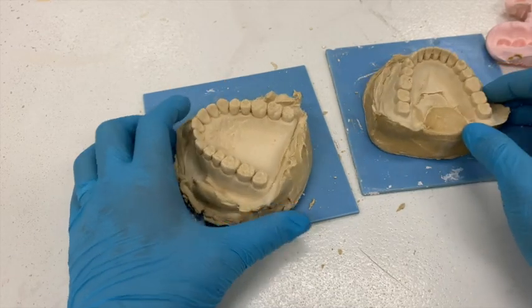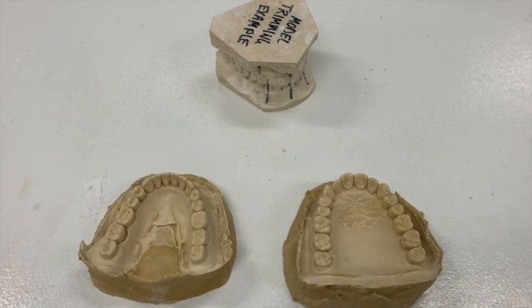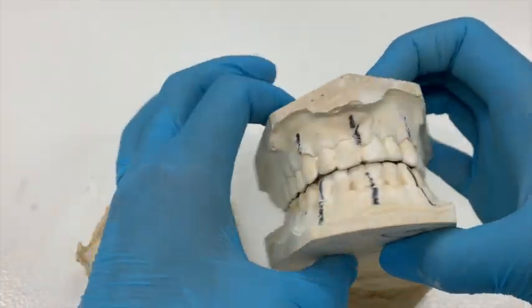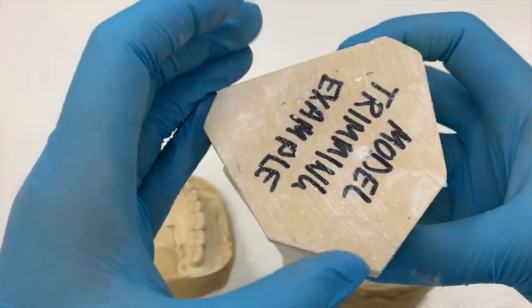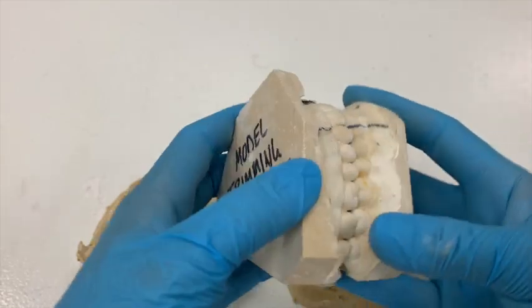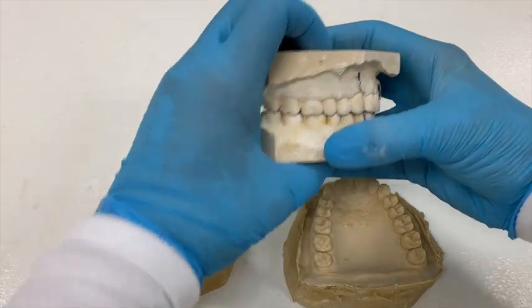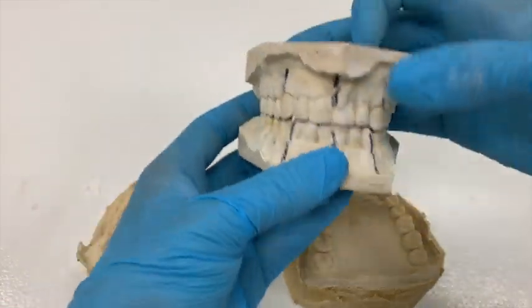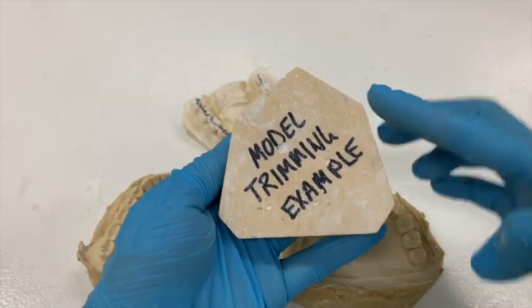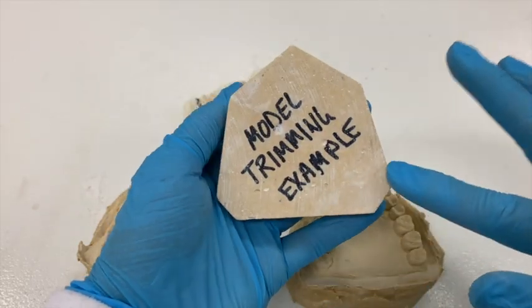The next step is going to be to trim these up, and that's what I'll show you now. We're going to trim our models. This is basically what we're going for — this is a very old dirty demo model, but I'm showing it for the general shape. You can see that when these sit they are fairly parallel, top and bottom, like a nice sandwich. The maxillary model has a very specific shape — nice straight lines, pointed edges, nothing rounded on this model.